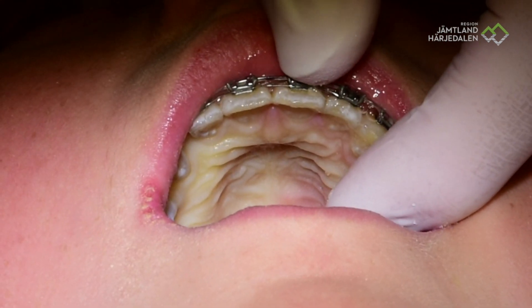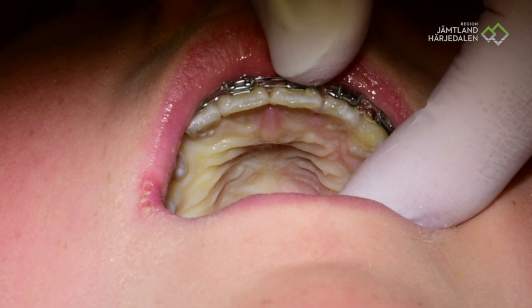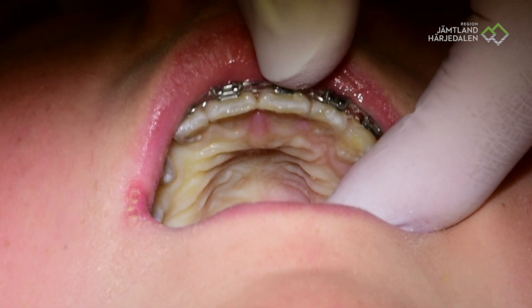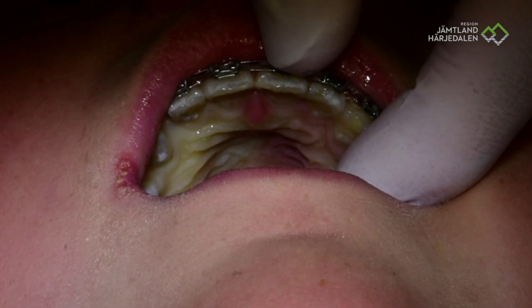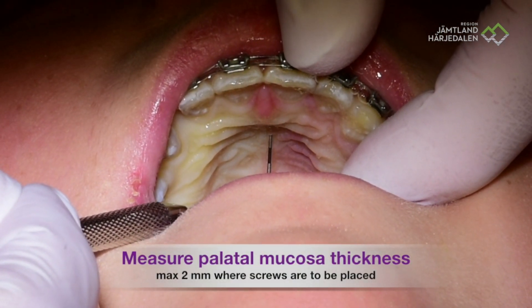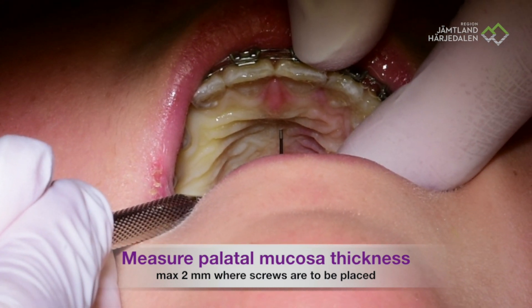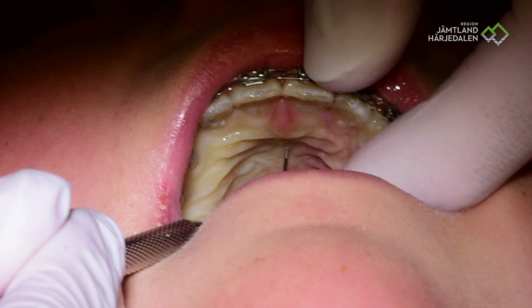You cannot feel any pain, but the other feelings you still have. This anesthesia will take the pain feeling away, but the stretching feeling and the tension feeling — you will get those. It is very normal. If I push really, really hard, you can feel the pressure. You can even hear the pressure that I am pushing. But nothing is painful.